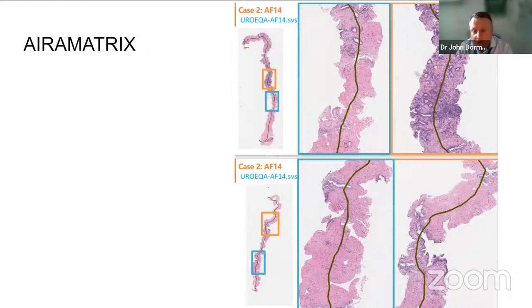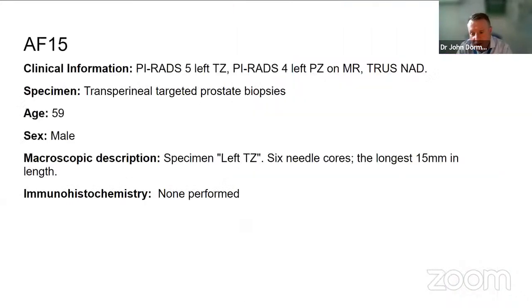This is the artificial intelligence, which didn't find anything in the cores that's of suspicion.